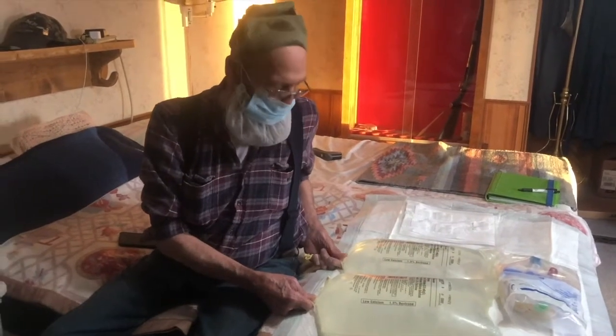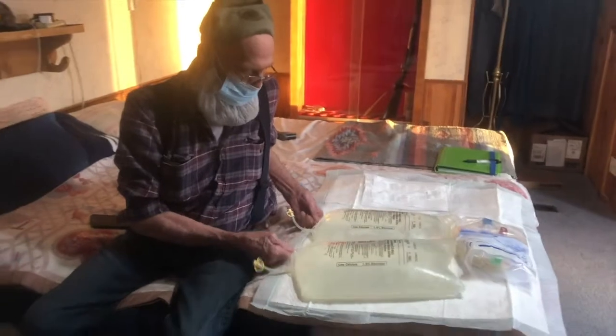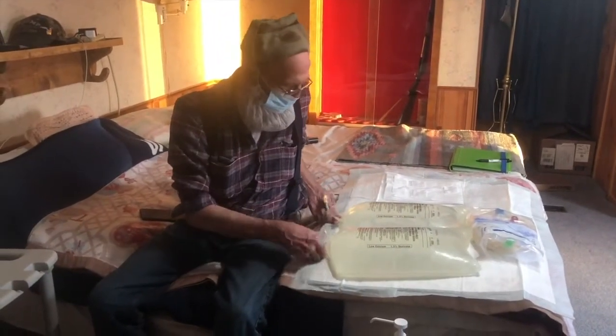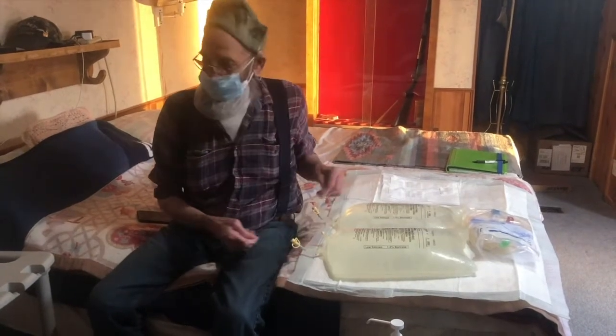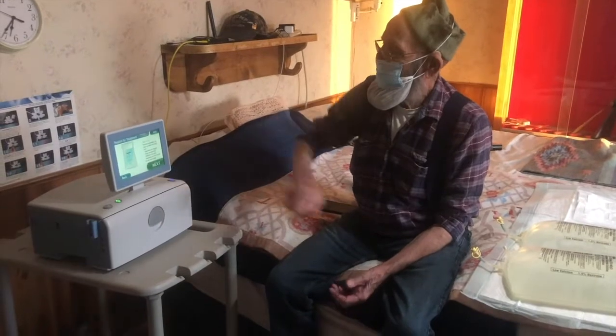Tonight we're doing heparin, so we want to make sure these little things here get pulled out to where they will work right. So, anyway, we got that right.